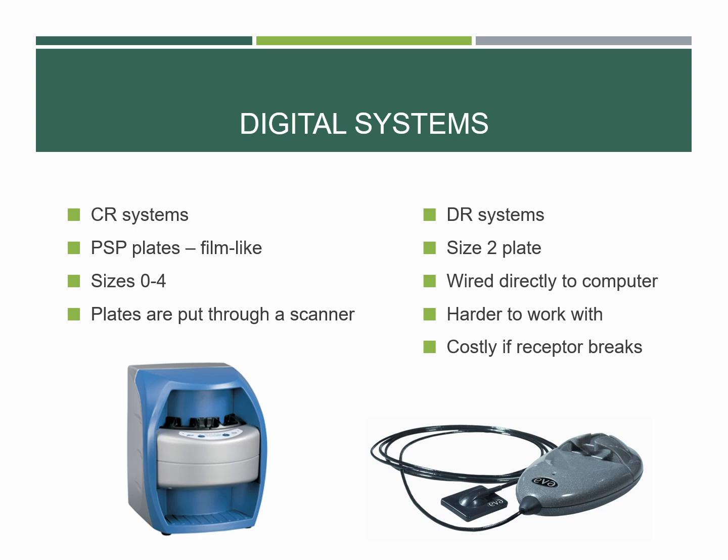Now, they're harder to work with because you've got that pesky cord. They're not flexible at all, so they don't flex or bend in the mouth. There's also a dead zone around the outside of the plate, so the usable area isn't actually the full size of the plate. You've got a little bit of space that nothing comes up on. And they're hard, so it's hard to fit in the mouth, and it's really costly. So we're going to read you the riot act about never dropping it on the floor, because if you wreck it, it's very expensive to replace.